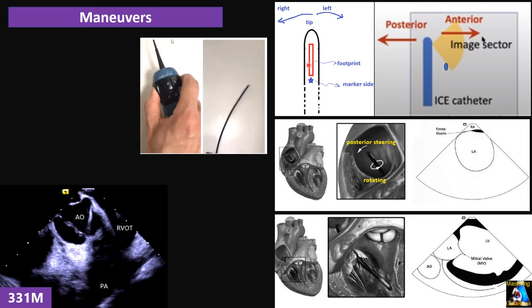Image A2 demonstrates the intracardiac echo evaluation of the interatrial septum from the right atrium. The area of the atrial septal defect at the site of prior transseptal puncture is evaluated and visualized with intracardiac echo. A small mobile clot, pointed with a red arrow at the site of the prior transseptal puncture, is detected by intracardiac echo and was not seen by TE. The procedure was canceled and anticoagulation continued for 6 weeks before attempting a second procedure.